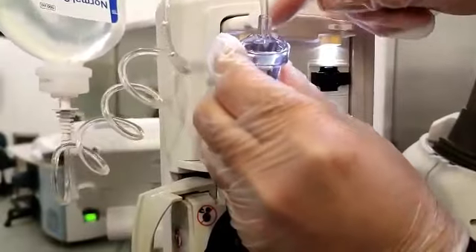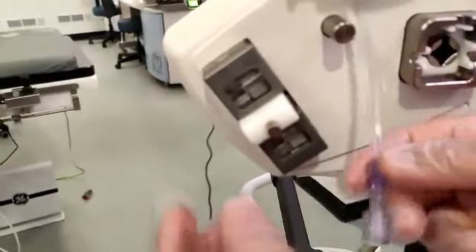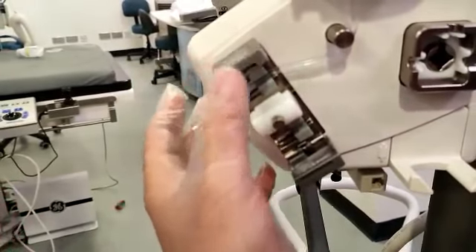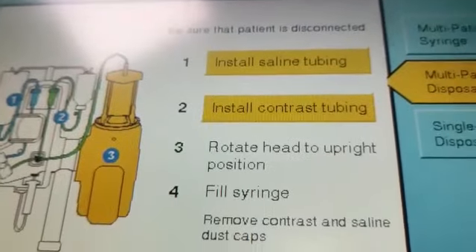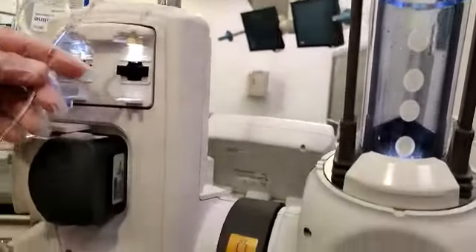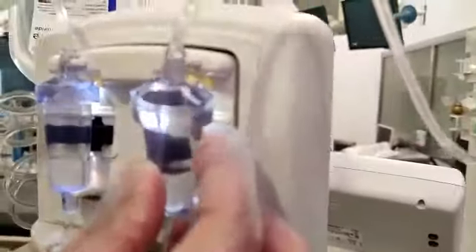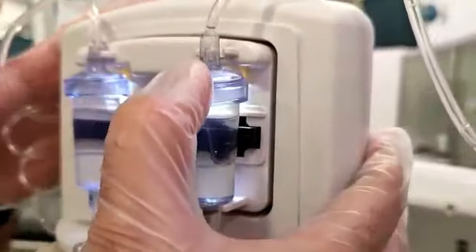There is a gap and a proper port — this side should go in, not the other side. You need to press the button to open it, then install the tubing inside properly and press it in — now the saline tubing is properly installed. Next, install the contrast tubing. In the multi-set there is another tubing. Same as the saline tubing — the chamber goes from the bottom first, there is a click sound, then fit it into the port with another click sound. Now you are done with both chambers.